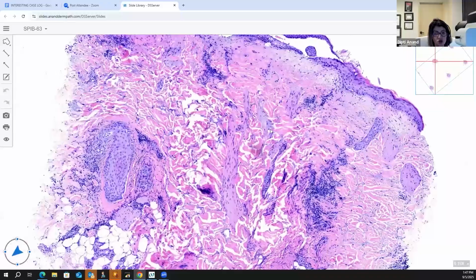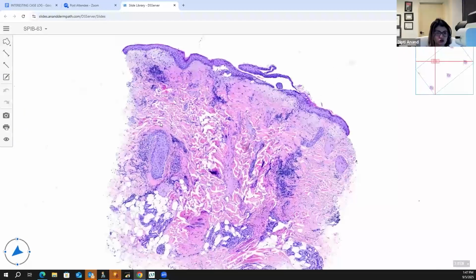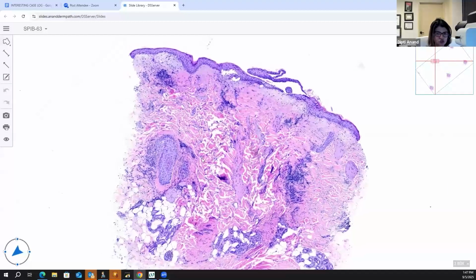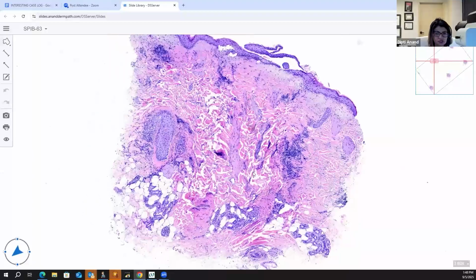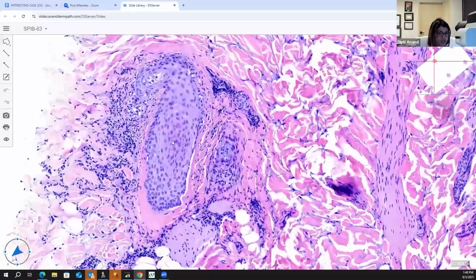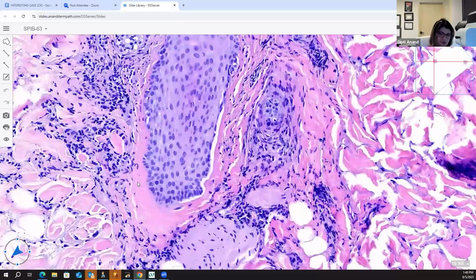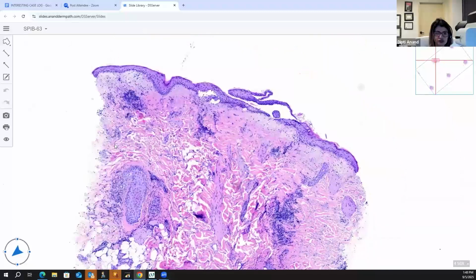This, on the other hand, is also from the scalp. And this patient also has alopecia because you see there are no hair follicles, except that this is not a horizontal section. I don't know whether this patient was biopsied for alopecia or not. Clearly not, because it was a process like that. But if you notice, there are not many hair follicles in this specimen. The hair follicle which is left over here, in contrast to the previous one I showed you, has no peripheral fibrosis, but it has a thick basement membrane. You see that? So you know where I'm heading towards.